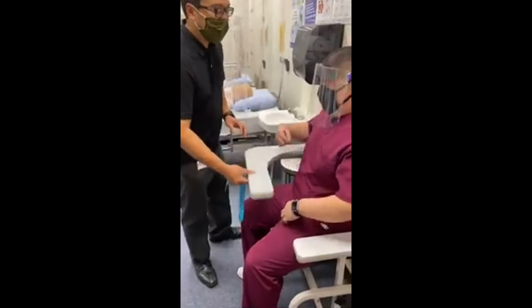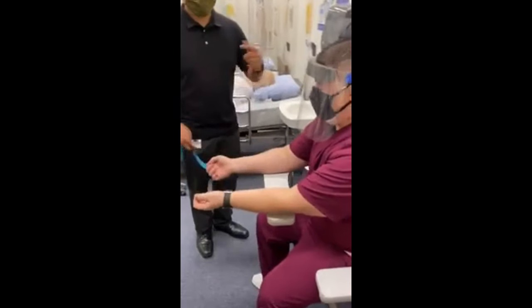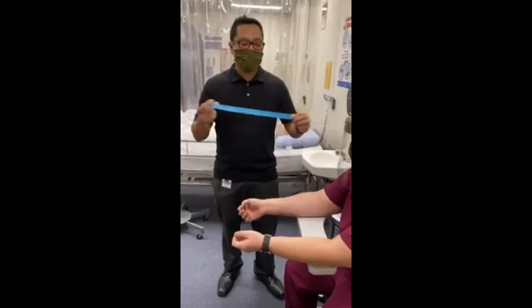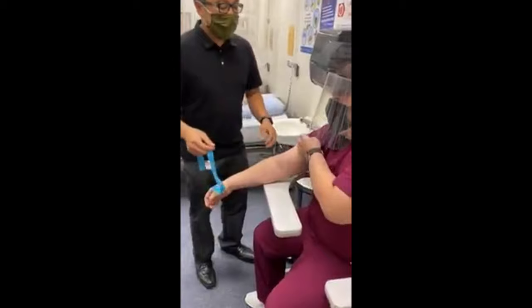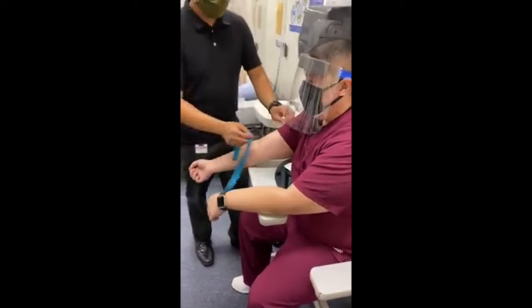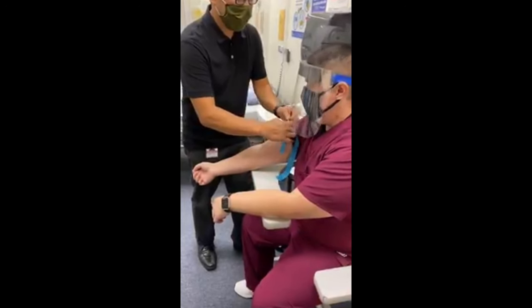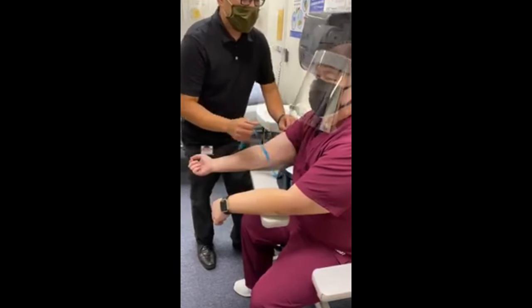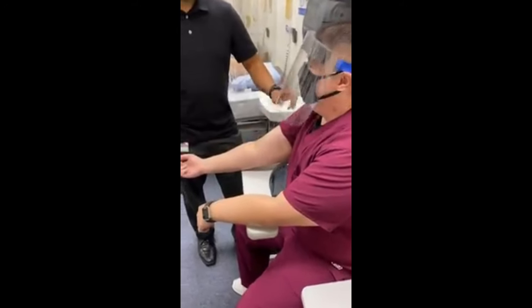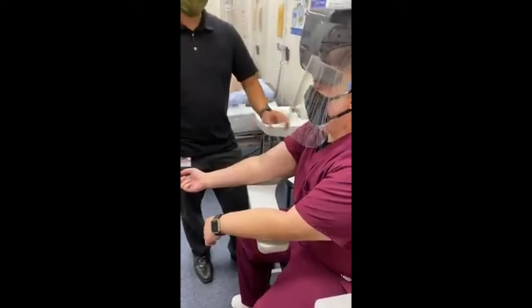I'm going to show you how to put it on and everything about the tourniquet. First things first, this is made of nitrile, so it's got a huge rubber band. When you put on the tourniquet, what I normally do is fold up the sleeve of the patient. Since Ryan is young and doesn't have loose skin, I pretty much roll it up. But if the skin is loose and has hair, then I would put it over the sleeve.